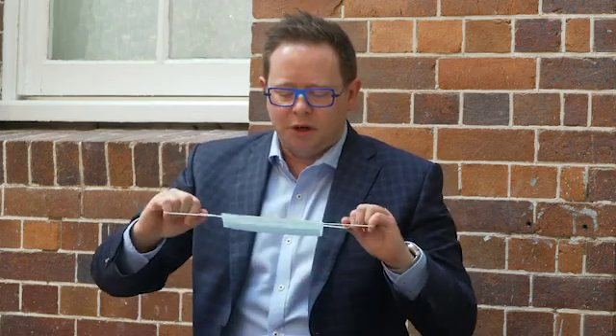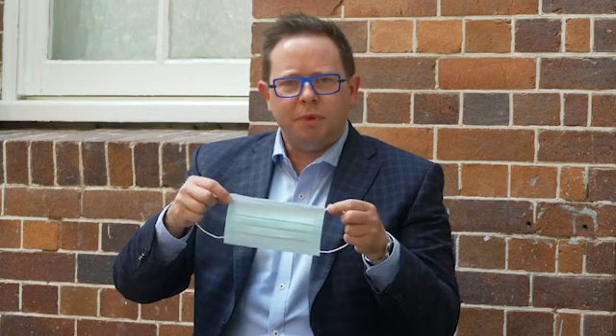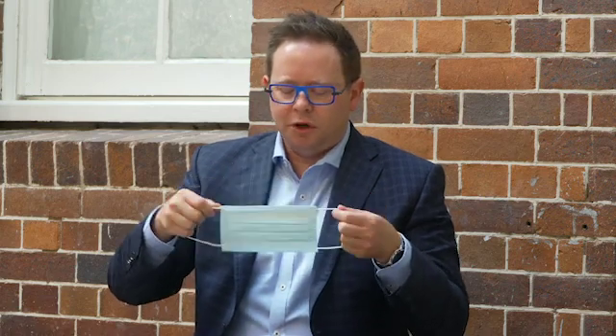Most masks have two colours, with the colourful side typically the outside, and also a top and a bottom with some kind of bendable metal bar or felt at the top that should go over your nose.